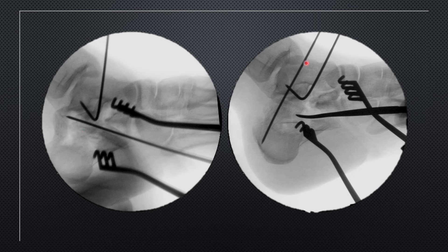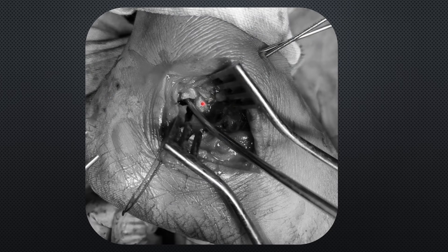What we have done here is transfix the talus with the tuberosity — that wire is passing through the medial part of the posterior facet which was attached to the sustentaculum tali. Now you see the articulation here is good, representing the medial part of the posterior facet which was aligned on CT. So we have restored the relationship of the tuberosity along with the medial part of the posterior facet and the talus. This reduction appears good. You can pass an additional k-wire through the talus into this medial fragment so that it remains stable while you perform other maneuvers to reduce the displaced lateral fragment.